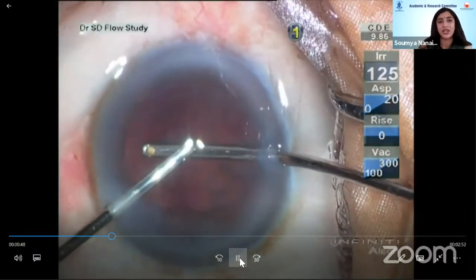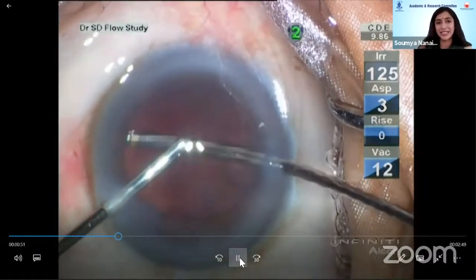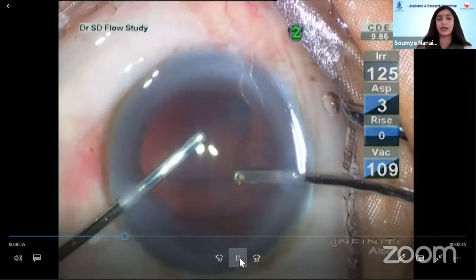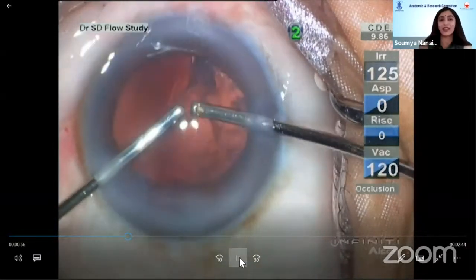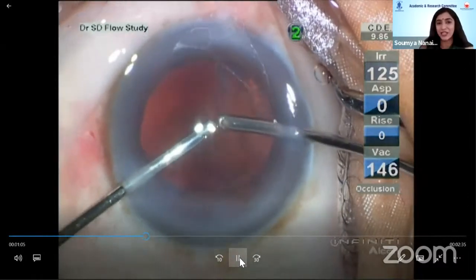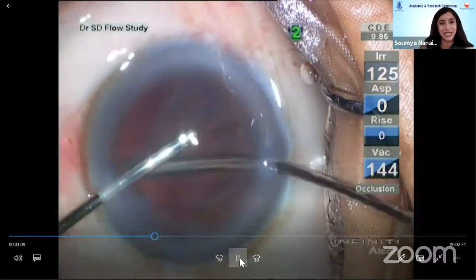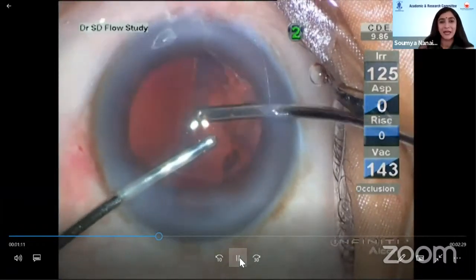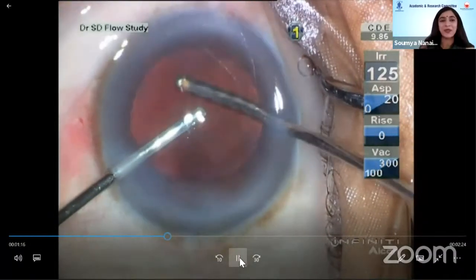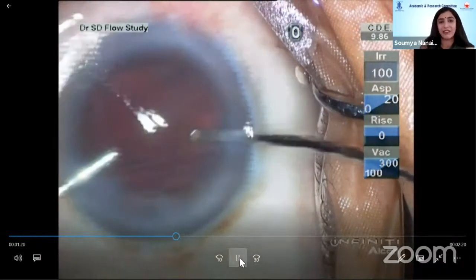In mature cataracts, we know that sometimes there is some pre-existing zonular dialysis, and the zonules are not as strong as in other cataracts. But the third time when it happens, it's definitely iatrogenic, and fortunately, it has finally been noticed at this point. And obviously, because of the scare, I abruptly let go, and the irrigation aspiration port, the cannula, has been removed.